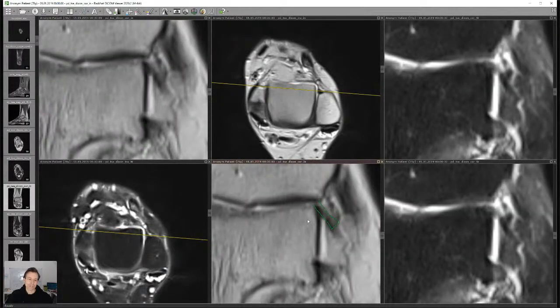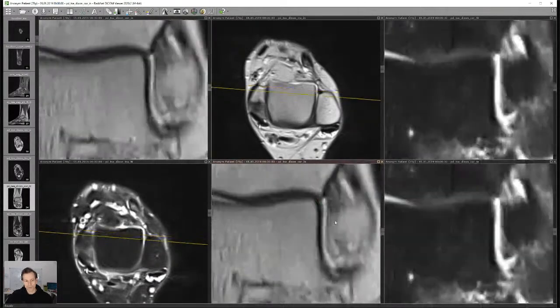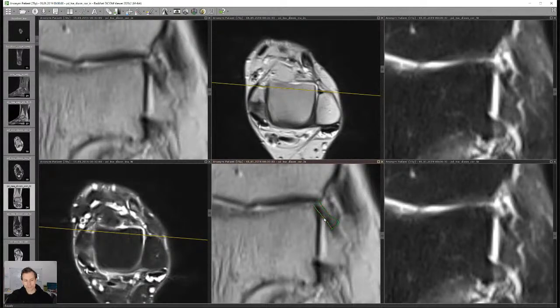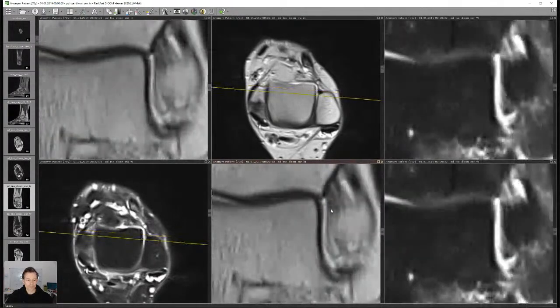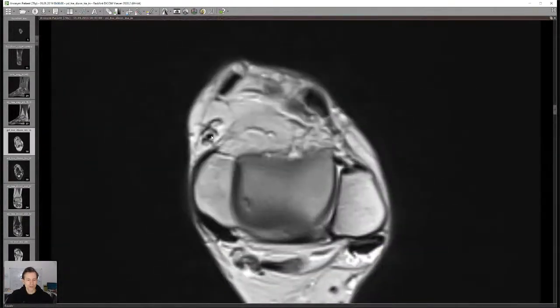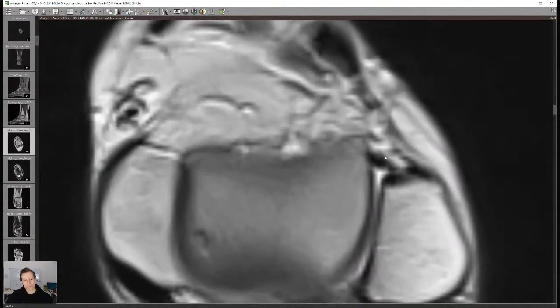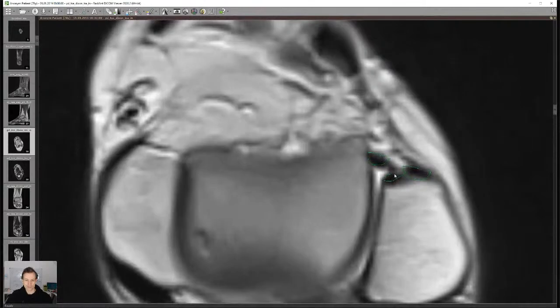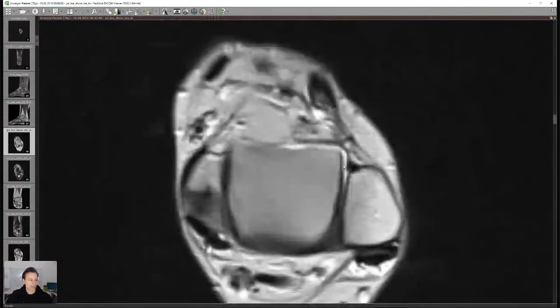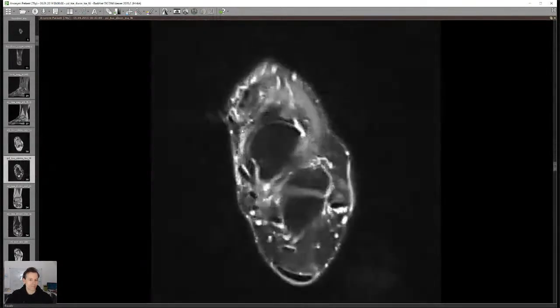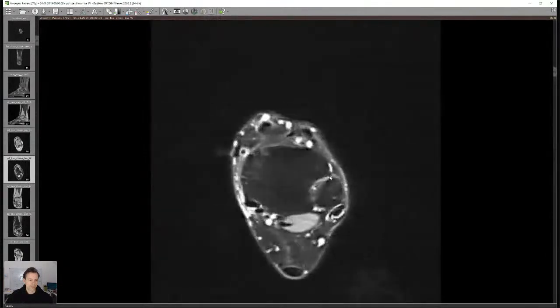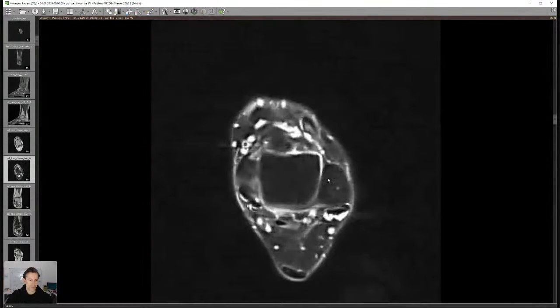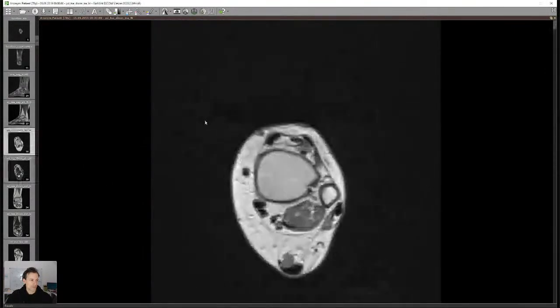If the Bassett ligament is very thick, some believe it can cause friction and impingement. It's not a separate ligament anatomically — it's part of the anterior syndesmosis. You can see multiple different bands that form the anterior syndesmosis. You don't want edema there. Then assess the posterior syndesmosis — nothing really remarkable here — and once both syndesmoses are covered, move on.